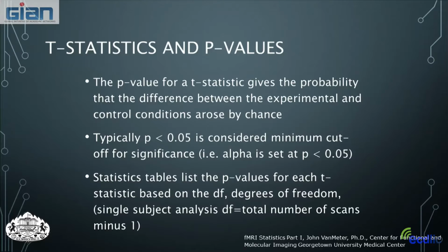Okay, so we can take our t measure and convert this to a probability measure and say this is the chance that this t value shows that this event would occur randomly or not. So this actually can give us a numerical measure of how confident we are that there is a difference between these two distributions. Okay, so this is our p measure.